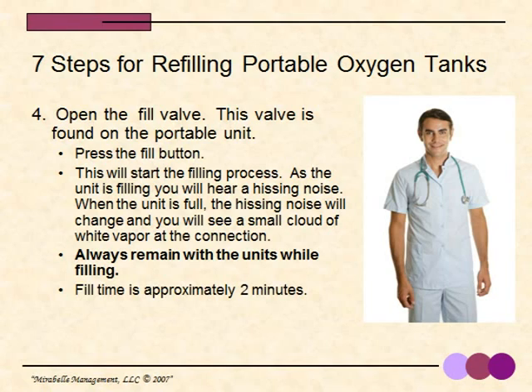You may work in a facility that has a special separate room for filling oxygen. This is a safety feature. But whether you're allowed to do it in the client's apartment or home or in your facility, there's a special room. Always remain with the equipment while you are filling it.